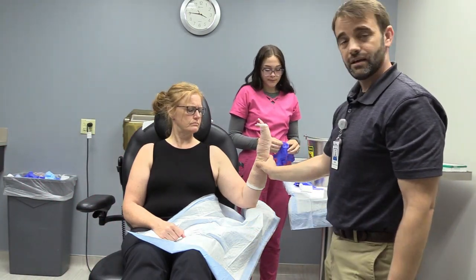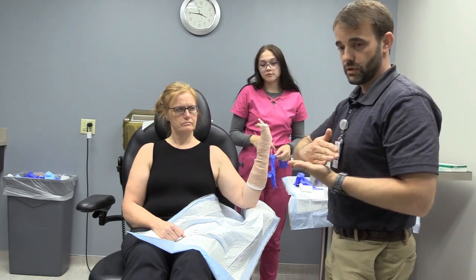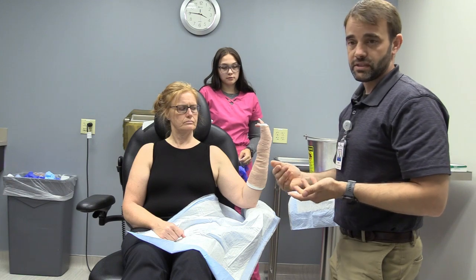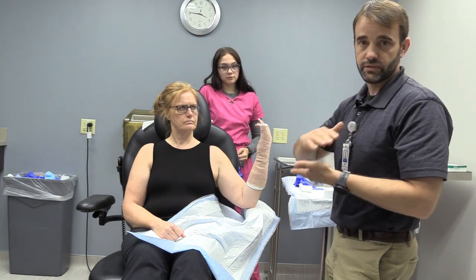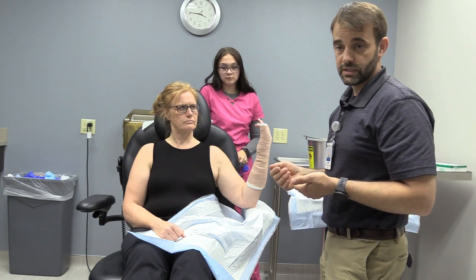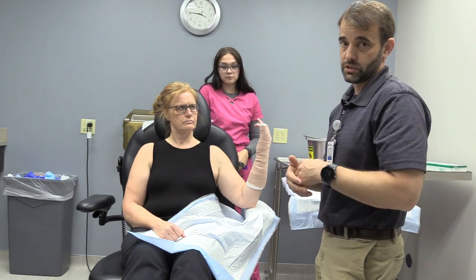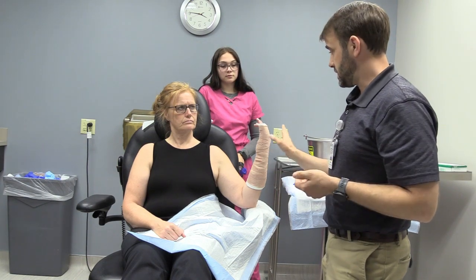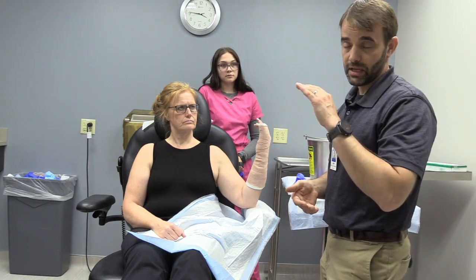It can take a crease from being rested on a hard surface for up to a half hour after being put in. So you just have to tell the patient, don't rest it on any hard surfaces, keep it on soft stuff. Slings are optional for this type of thing. Sometimes I like to give them a sling just so they remember to be careful with it or to prevent jostling too much. But the main thing is to get them well immobilized and tell them to elevate to prevent swelling.